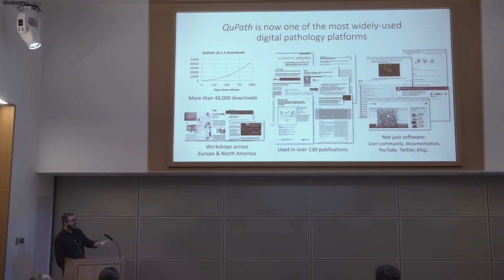But in order to support that, there needs to be a community that exists online, and it involves creating the documentation, tutorials, and teaching materials as well. So the initial publications behind it are just a very, very small part. The overwhelming majority of the work is in developing and supporting the software.